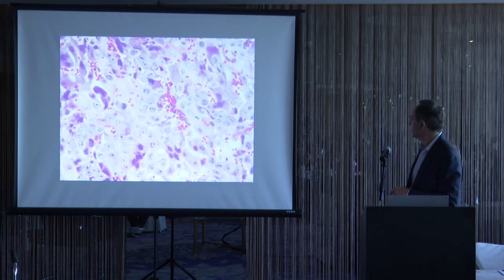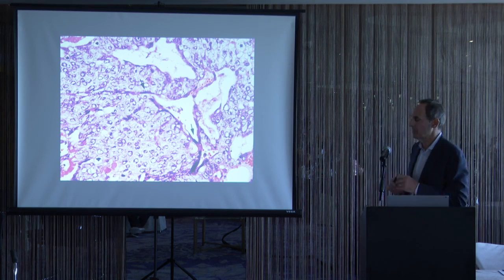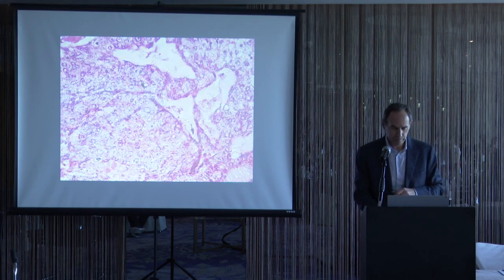Another example of choriocarcinoma with these syncytial trophoblasts, which sometimes can get kind of smudgy and somewhat pycnotic with abundant cytotrophoblastic cells. Sometimes in choriocarcinoma, the syncytial trophoblast can be relatively inapparent if you do not know what you're looking for. Here we see all of these cytotrophoblasts, and then the syncytial trophoblasts are just capping the cytotrophoblasts, with these multinucleated cells just draped over the surface of them, but again, not as apparent as the prior cases that I showed.